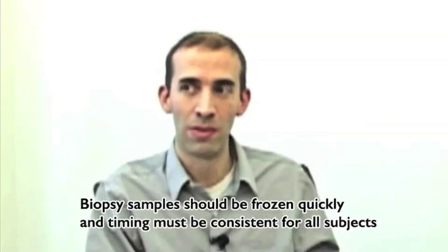And it's also important to have very consistent timing from subject to subject. You want to be sure that you design the experiment in such a way that you can collect your samples quickly and be able to follow a very, very consistent and very fast time course in all of your subjects so that you can get consistent data from one individual to the next. Do you have any other recommendations for our viewers?